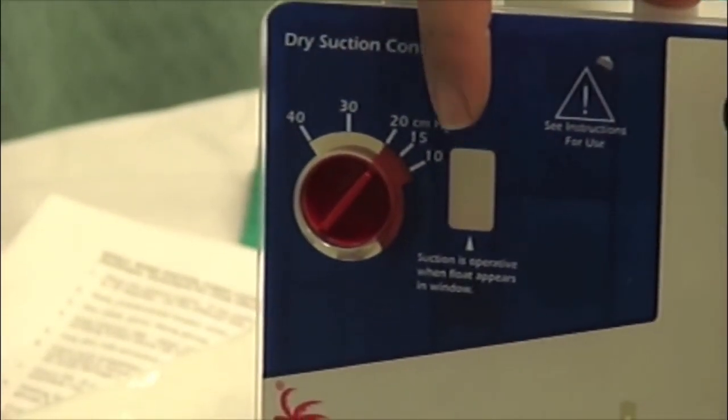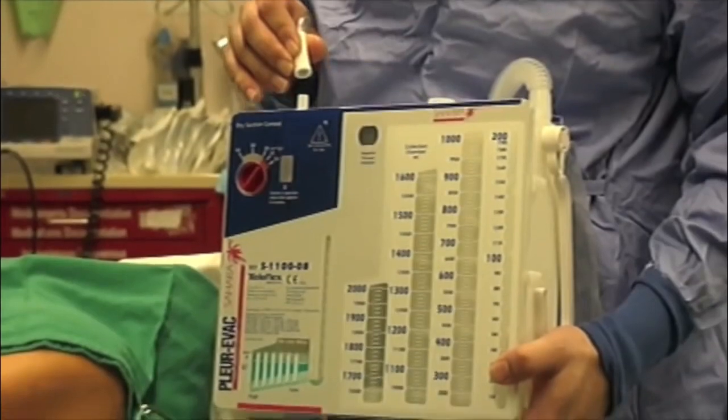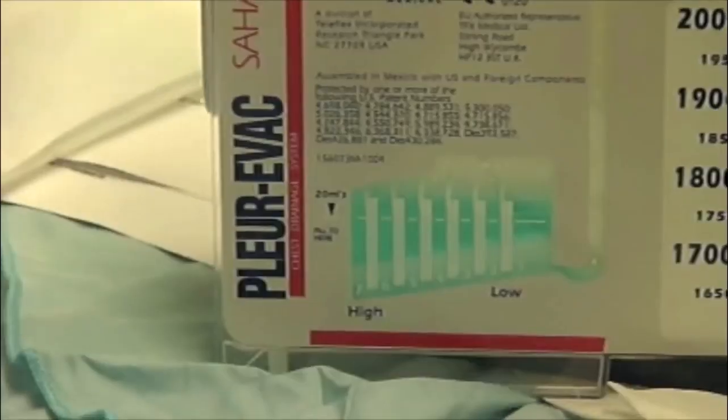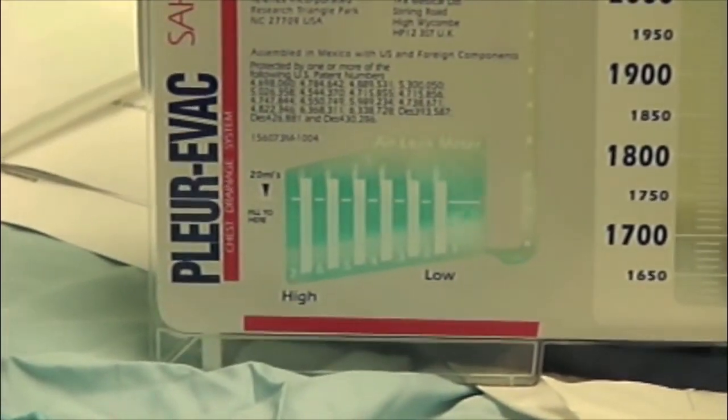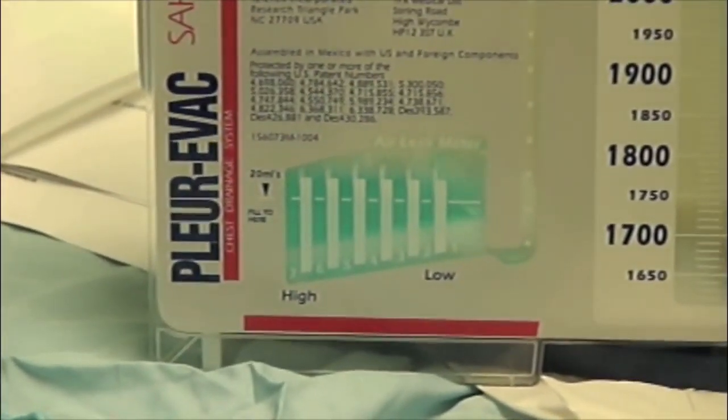Set the suction to -20 centimeters of water. You should observe the orange float rising once the wall suction is applied. Bubbles will appear in the air leak meter if there is an air leak, or if patient coughs.